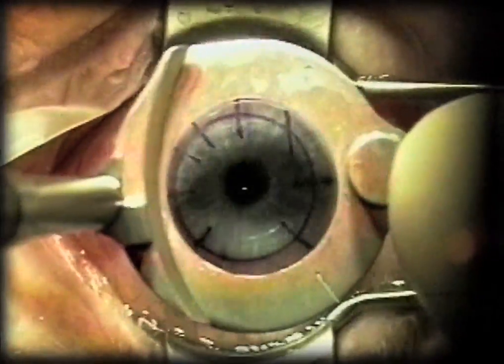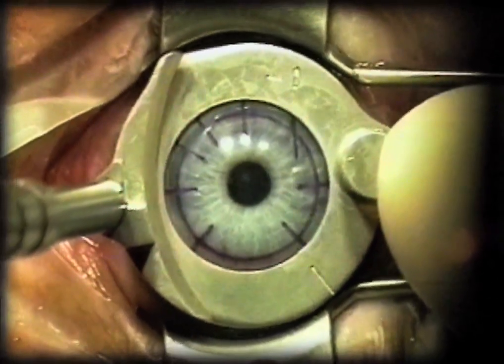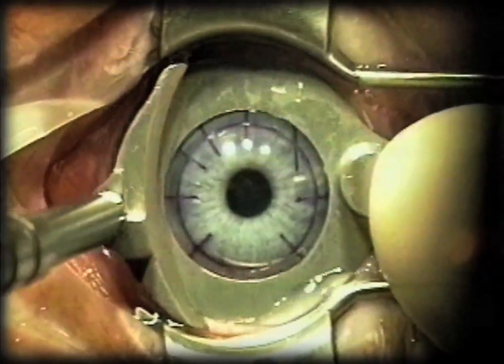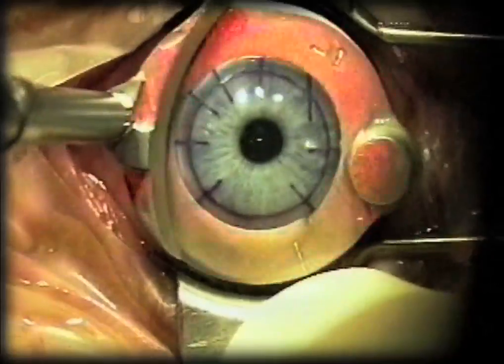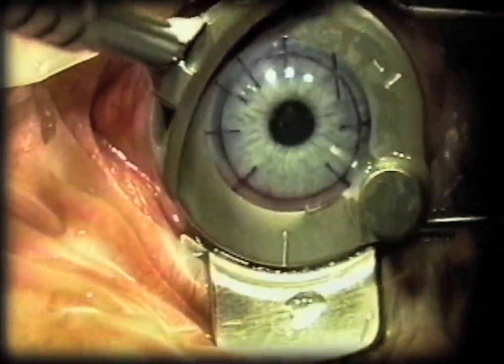This is the Moria CB ring. You can see how it sits in nicely between the blades of the speculum. Press down and get suction. Once suction is established, you'll see how I can lift it up and rotate it to maximally expose the sides of the ring so that there will be no impedance to the traversing of the Moria head from the lid speculum.